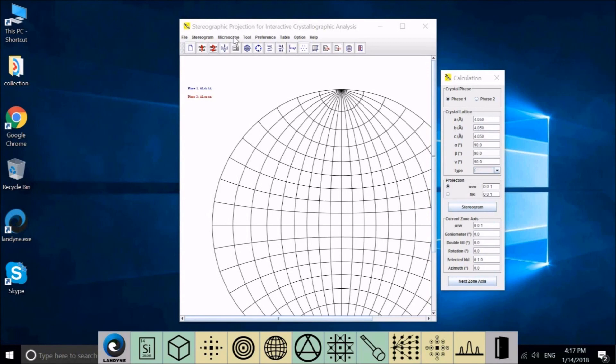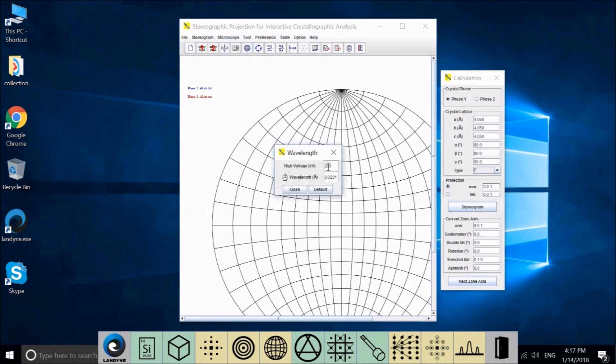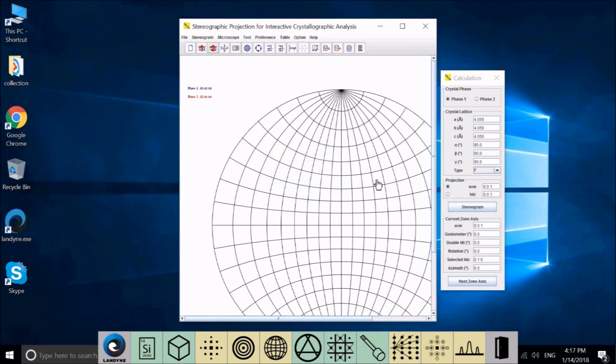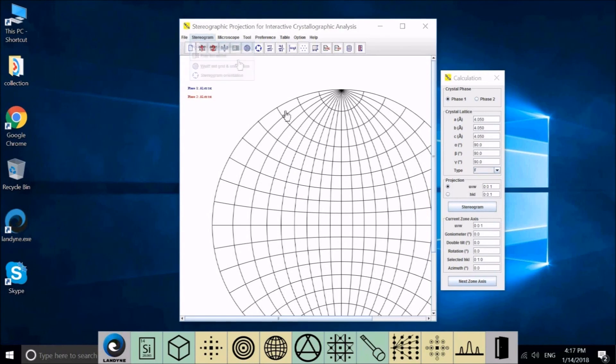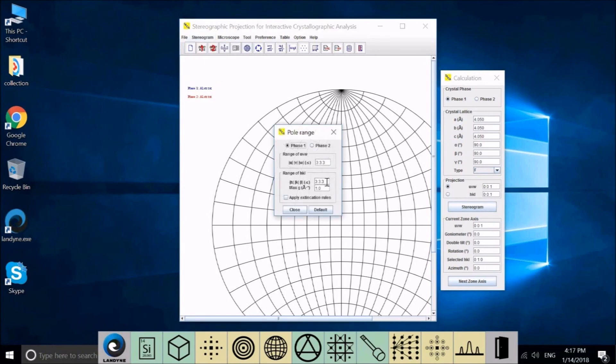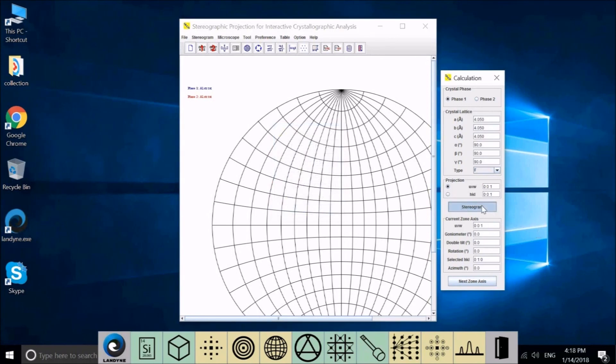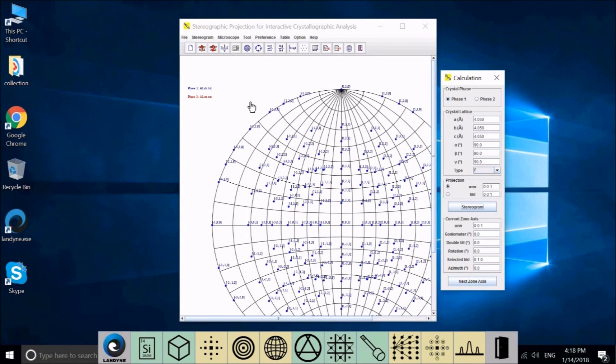We still use aluminum in phase one and phase two also aluminum to demonstrate how to generate Kikuchi maps. The first one will generate the map and the second one is used for indexing that map. The Kikuchi map is related to the high tension or the wavelength. The default is 200 kV. And this is the wavelength. If you change it, you can change it directly, the wavelength, or change the high tension here and click. The corresponding wavelength will show here.